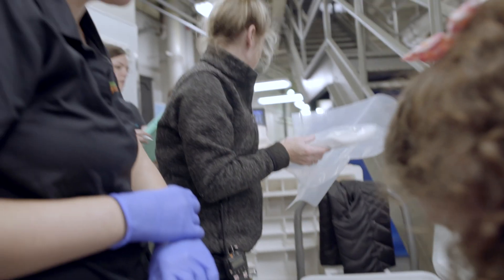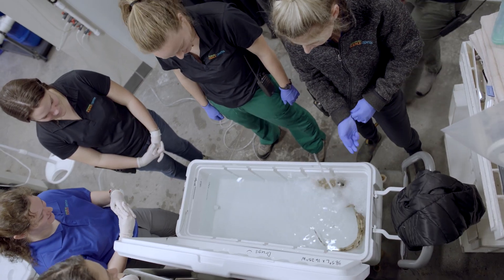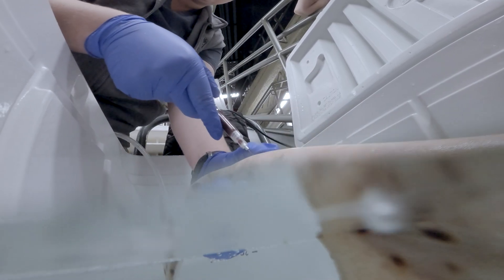Once the shark is in a good anesthetic plane, the first thing we'll do is get a blood sample. To do that, we flip the shark upside down so we can have access to the bottom of the tail, because that's where we collect blood from on these sharks.